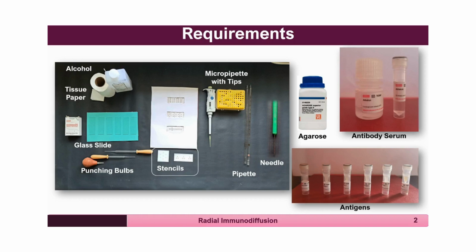You will require microscope slides, and tissue paper, and ethanol is used by moistening the tissue paper to clean those microscope slides. The surface of the microscope slide should be free from fingerprint. It can be cleaned by wiping the ethanol on its surface. Once it is clean, the fingerprint should not come on it. Then those slides are laid horizontally on a uniform surface.